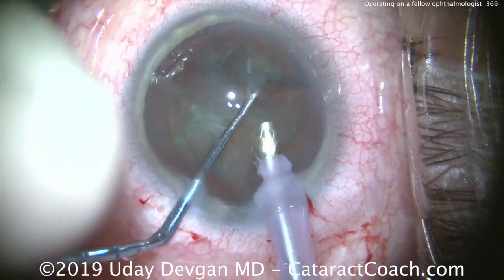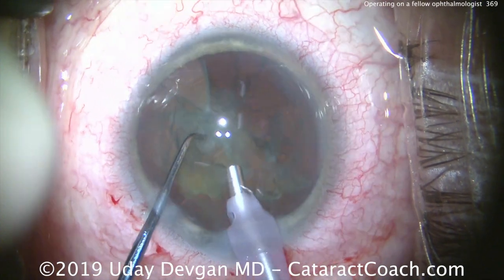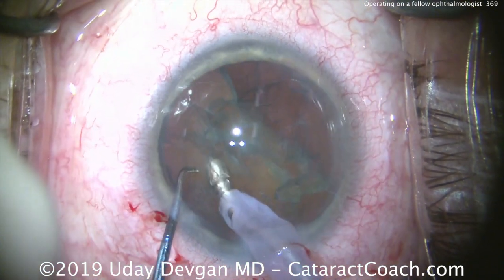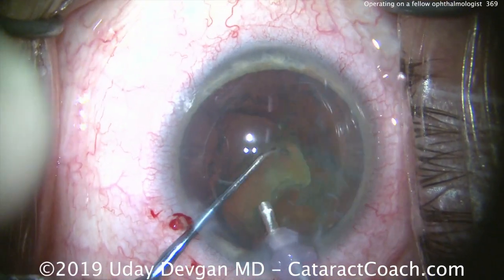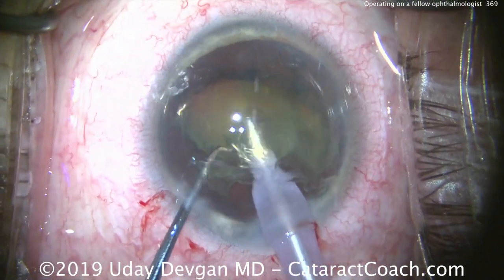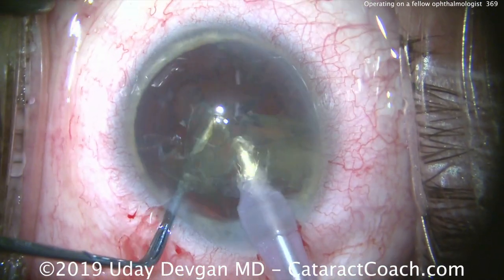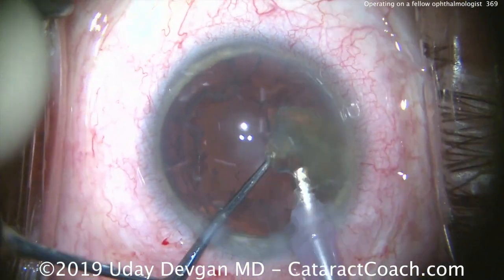Of course, if you yourself are an ophthalmologist, you probably won't wait until you have a brunescent or dense cataract. You'll probably want surgery sooner. So these pieces come up pretty easily. Not much issue there, nice and soft. The key, of course, is let's not damage that posterior capsule. So using that second hand, the chopper, to really bring the pieces up. Again, not a difficult case. The stress for me is mostly mental. The patient was one of my mentors who taught me cataract surgery 20 years before. And so I had to be very careful.